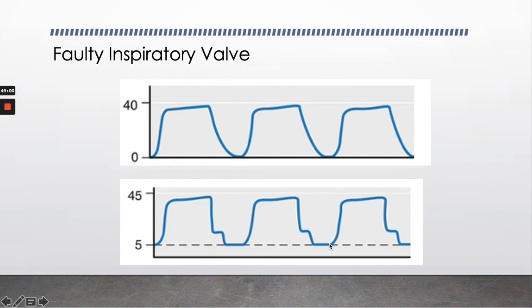And this is due to the patient having CO2 in the inspiratory limb of the breathing circuit. CO2 has entered into the inspiratory limb. So this is what's going on here. As the patient begins to breathe in, initially they're washing out the CO2, and then we have this extension right here, because it's extending phase 0, and then it starts to pick back up instead of reaching back down to baseline, because it should return to 0.